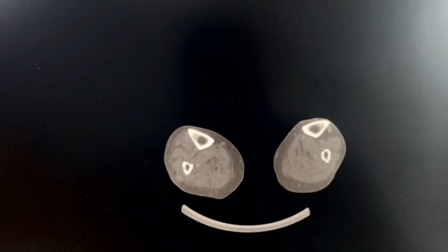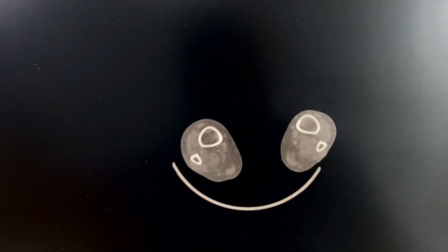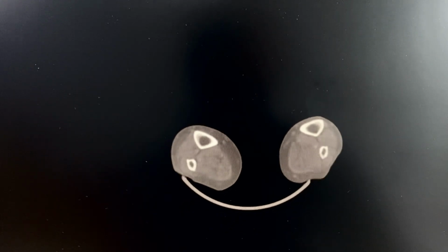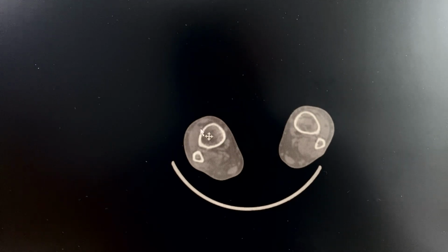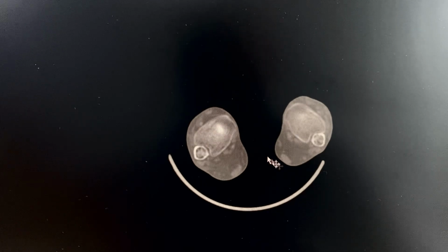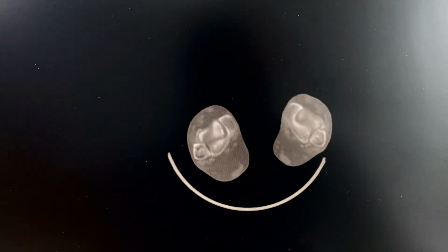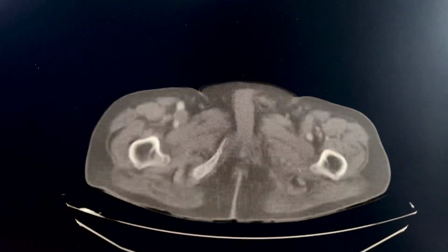But it's an interesting case, given his arrhythmia, atrial fibrillation, and very, very strong pulses, I was able to feel the anterior tibial artery pulsating. You can feel it pulsating despite, as you can see, it's intact below, although above there are some occlusive changes there. But when you go to the foot, the anterior tibial artery is patent and it's pulsating quite remarkably.